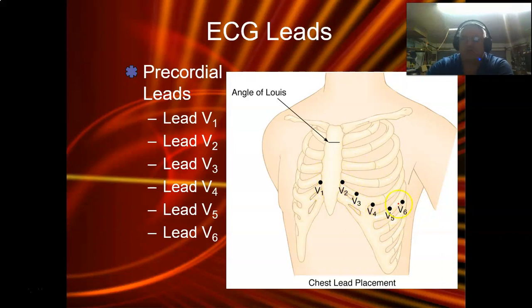It looks really good at the lateral wall of the heart. The other leads show us the inferior wall of the heart. Nothing really shows us the right ventricle. There's nothing showing us that. By the way, nothing's showing us the back of the heart, okay? So that's where those other leads come into play about diagnosing a patient having a heart attack.